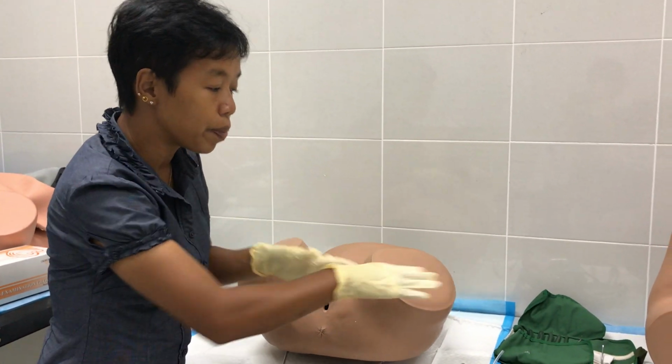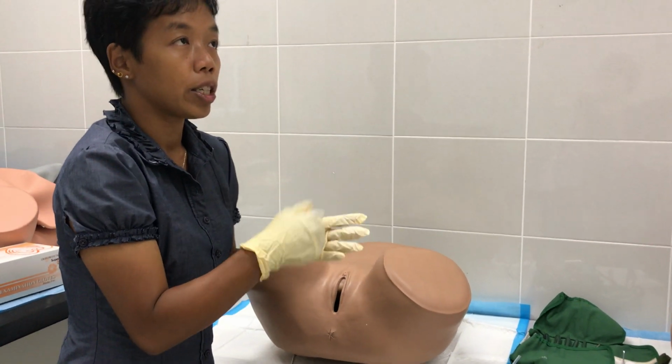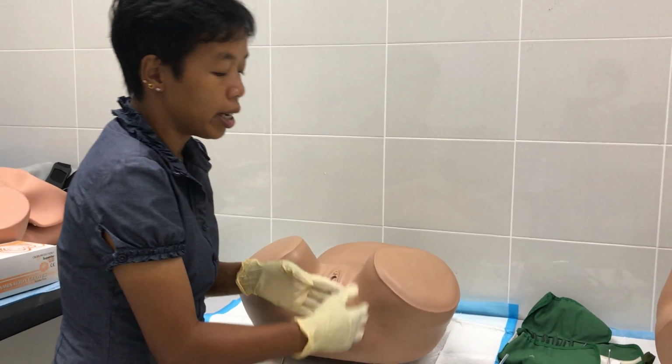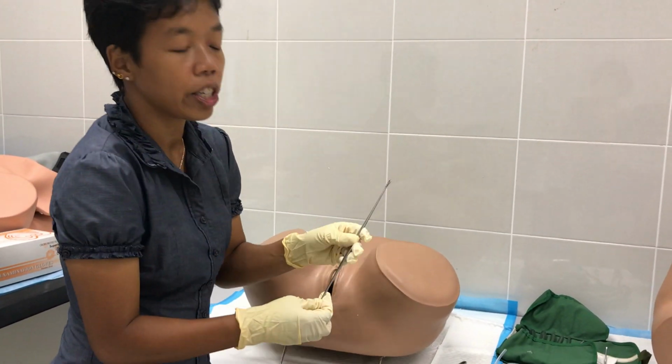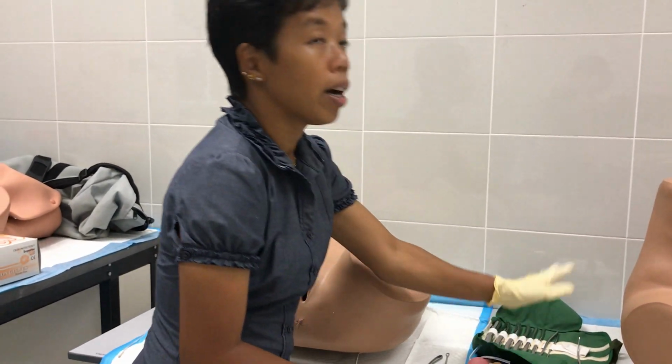So you can use the same technique for suction curettage or hysteroscopy as well. But this one is just an example for dilatation and curettage. But you can use the same principle using all the instruments for the other procedures.